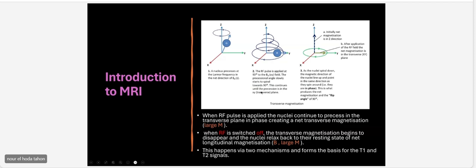So here, for example, when we switch it on and off, see now, this is the direction in the transverse plane, and this is named the transverse magnetization. We are able to measure the transverse magnetization to have images. Now I'm talking about the T1 creation for images.